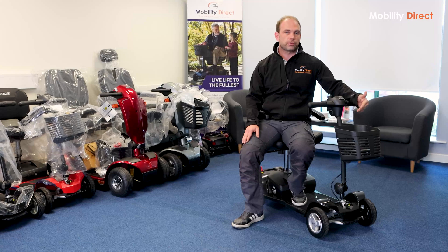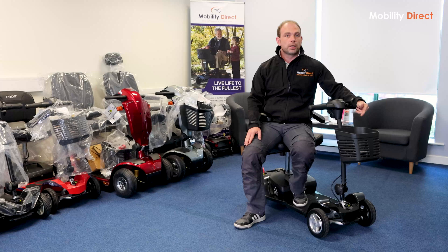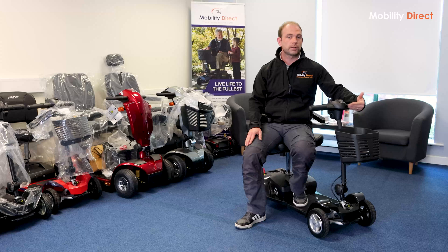The main difference in weight stems from the change in battery from lead-acid to lithium. Generally speaking, lithium batteries are much, much lighter than lead-acid batteries. In this case, there's a 70% difference in weight, which is a huge difference. The lead-acid batteries on the Apex Light, for the standard size, weigh 8.8 kilograms, and on the Alumilite with the lithium battery, they only weigh 2.5 kilograms. That is a noticeable difference.